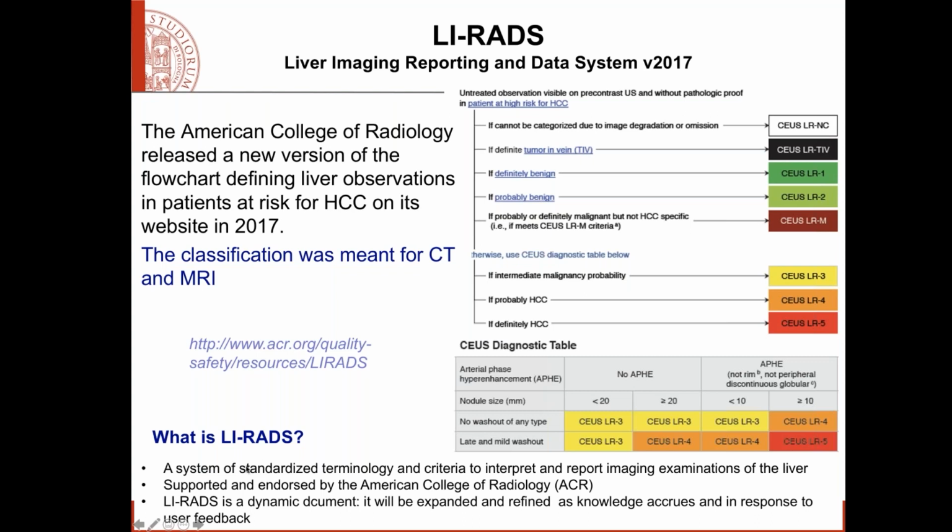What is the goal of the LI-RADS? It has the aim of standardizing terminology and criteria to interpret and report imaging examinations of the liver, because in many different countries there were different modalities to express, for instance, the appearance: hypervascular lesion, washing in lesion, hyper-enhancing lesion, bright lesion, hyperechoic lesions, and then we don't know in the end what the imaging experts are talking about.